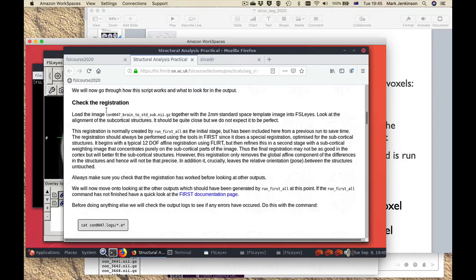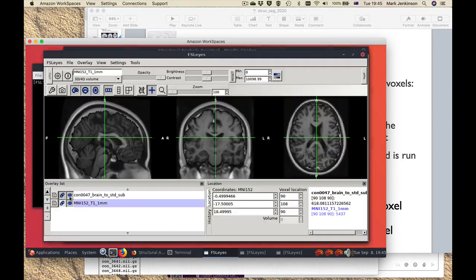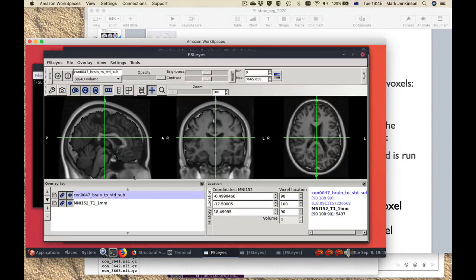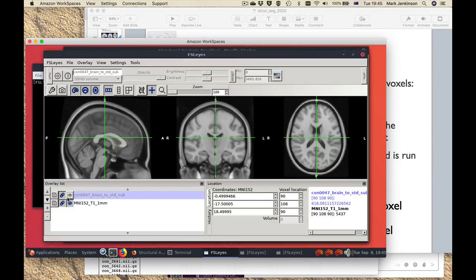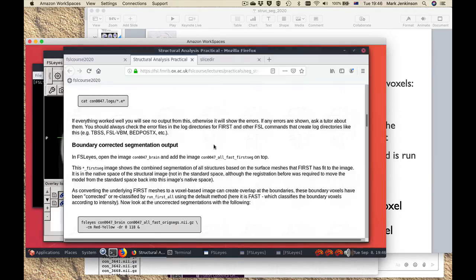Importantly we still want to check the registration, so one of the things to do is look at these images, which will show you the registered image on top of the standard space it's being registered to. Ignore the stuff around the edge — this is subcortical registration so all we really care about is how well it's doing in the subcortical structures, and it's really doing that for initialization. It's far from perfect in many places but quite close to where it needs to be. You'll also be asked to check whether there are any errors in the logs. When you run that command in your terminal it should give you nothing as output — simply the next prompt with no output at all. That's a good thing; we don't want to see any errors.